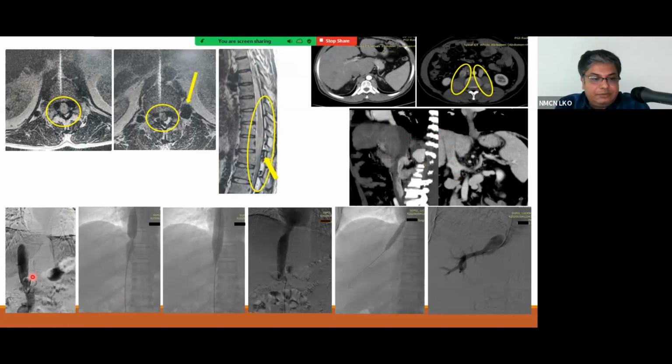On venography, performed from the transfemoral route, we see a complete, smooth obstruction at the level of the upper hepatic IVC. This was gradually navigated with the guide wire and catheter, and over the wire, a balloon was placed across the occluded, stenotic segment.